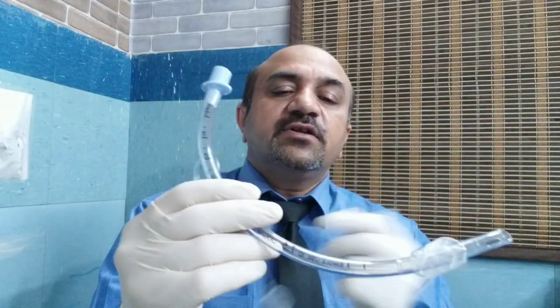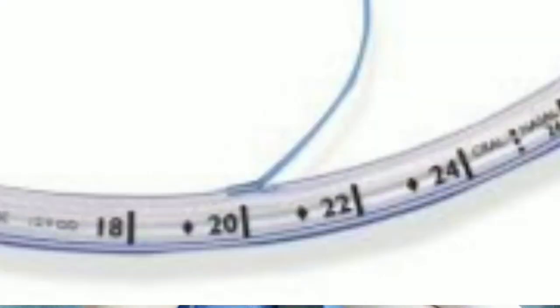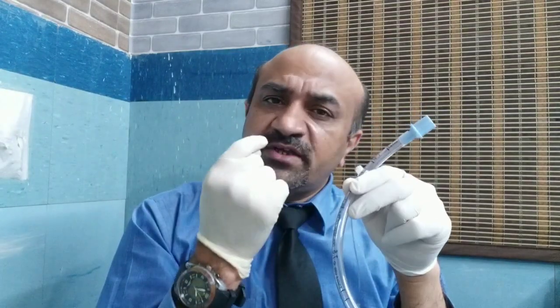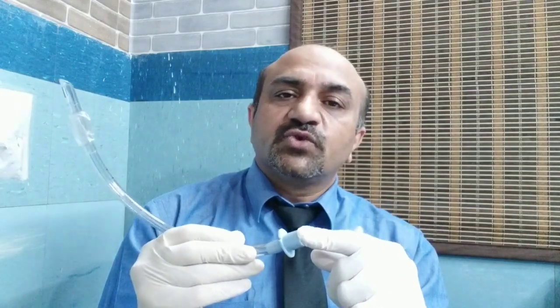Now there are certain graduations. If you can see, these are located here. Here, 7.5 is the ID. ID is the internal diameter. Then there are certain gradings in centimeters. Normally in a female, we place it at 21 centimeters, and in the male we place the tube on the incisor teeth at 22 centimeters. Other than this is the connector, which is 15 millimeter, and here we attach the oxygen source.